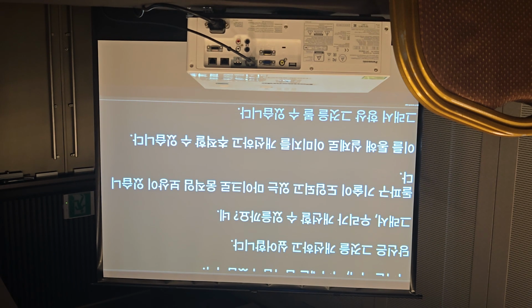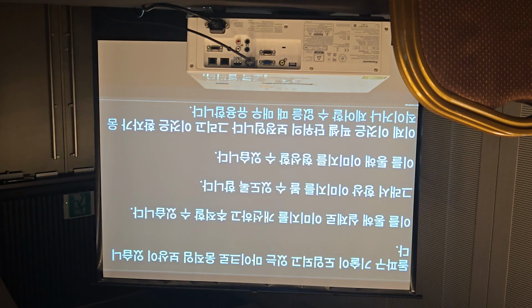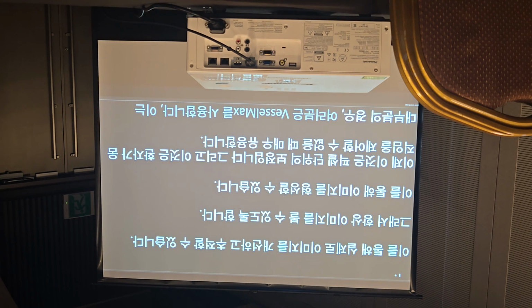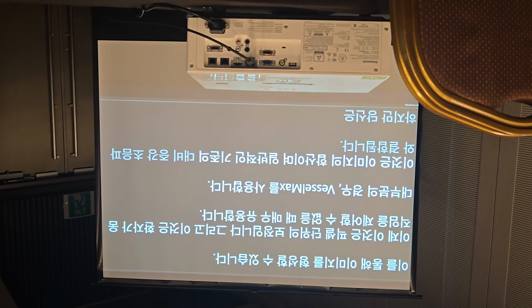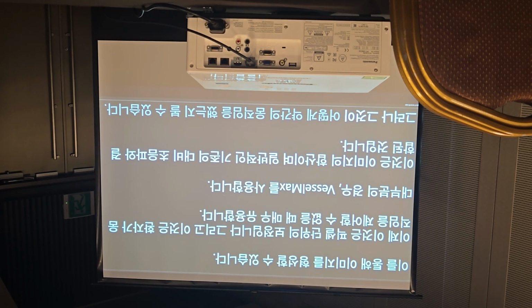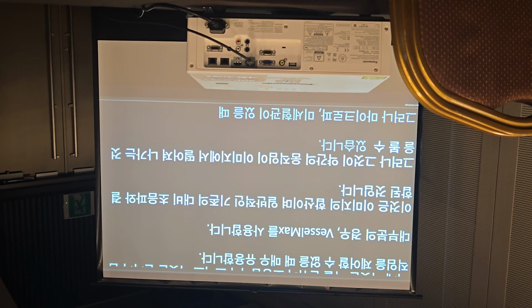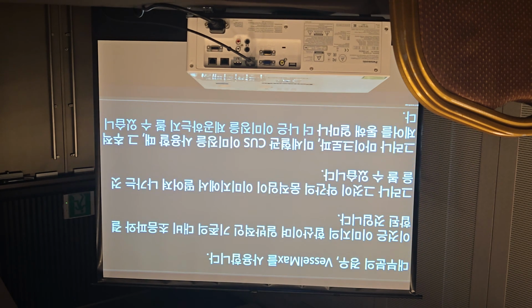So this is now pixel-wise correction, and this really is very useful for when you have that movement or the patient cannot control the movement and you're watching it. So most of you use vessel max, which is a summation of the imaging on just normal conventional contrast-enhanced ultrasound, but you can see how that little bit of movement detracts from that image. But when you've got your microvascular CUS imaging, with that tracking control, you can see how much better that imaging and the look at the vascularity of that tumor has improved considerably.